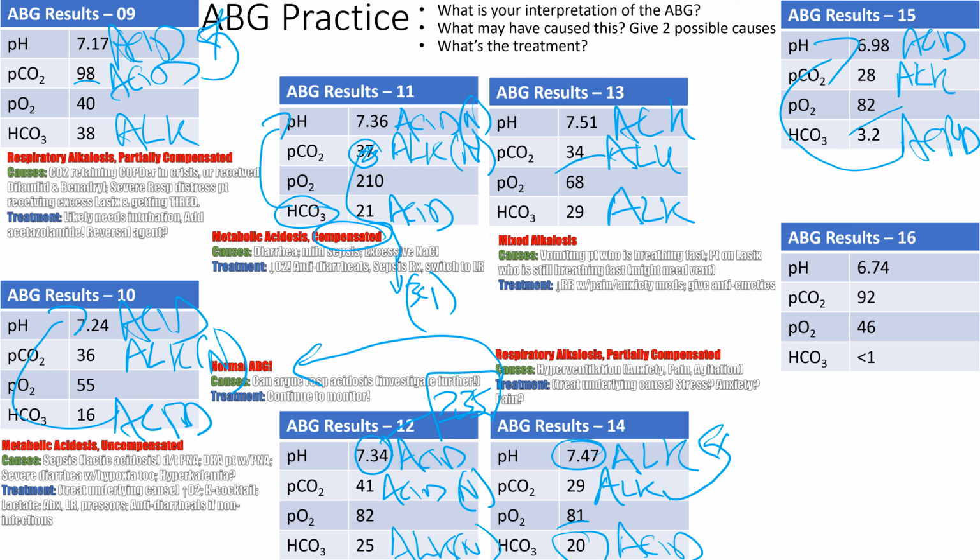But you're adding acids to the solution, such as ketones. DKA patients commonly come in like this, right? They have extreme acidosis, right? They're usually younger people and they can tolerate these extreme changes, right? So they have a severe, what kind of acidosis? Severe metabolic acidosis. Is it compensated? Is it fully compensated? Absolutely not. Is it partial? Yep, partial compensation, right? The CO2 is trying to fix this extremely acidotic state, right? So how do we fix DKA? It's FIE: fluids, insulin, and electrolytes, right?